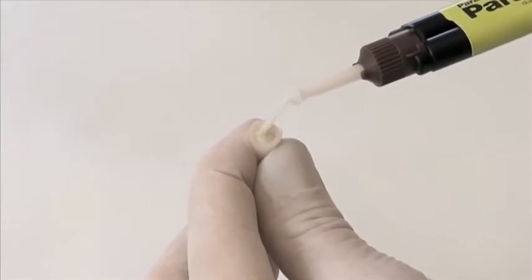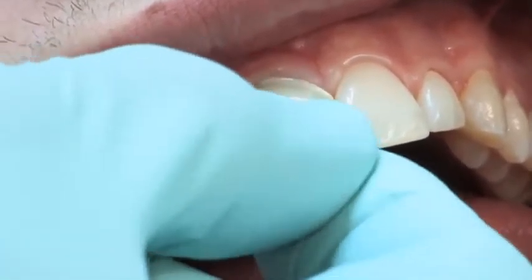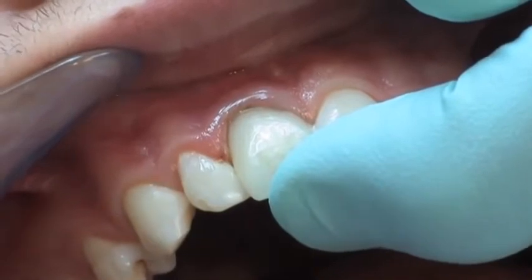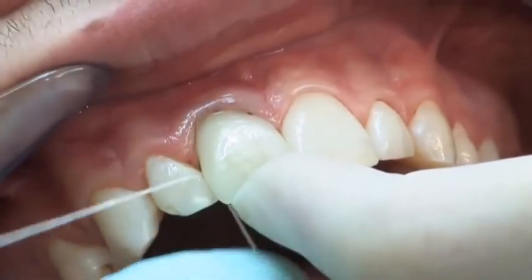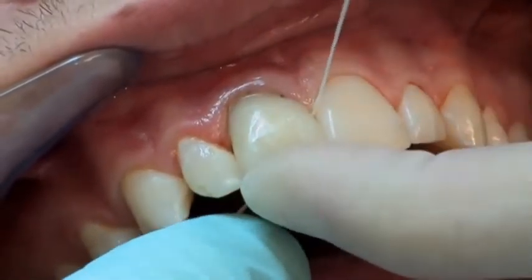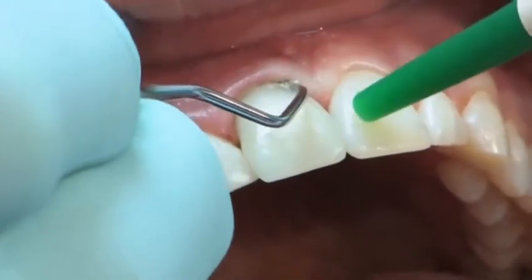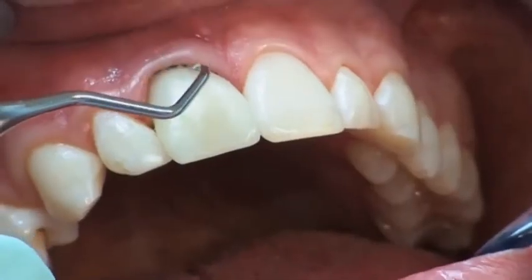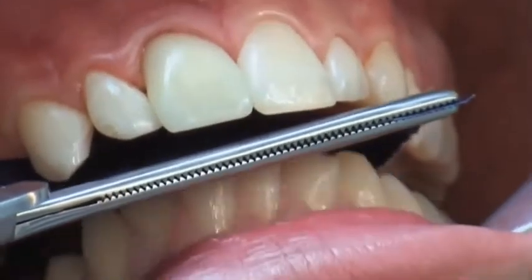The application of Paracore for the cementation of posts, restorations, and core build-ups guarantees an optimal monoblock bond interface between the post, cement, dentin, and crown, resulting in one cohesive restoration with outstanding durability and strength. The restoration is held in place with increased pressure and excess cement is removed. Once Paracore reaches a gel-like consistency, excess cement should no longer be removed. Residual excess cement and the retraction cord are removed using a scaler after the cement has completely cured. The occlusion is thoroughly checked.